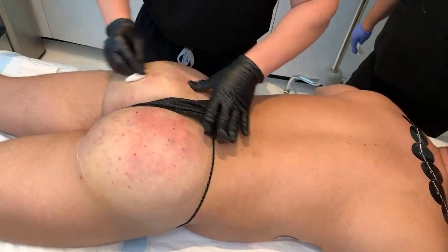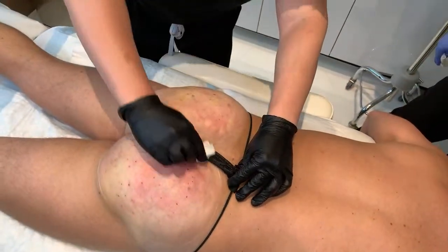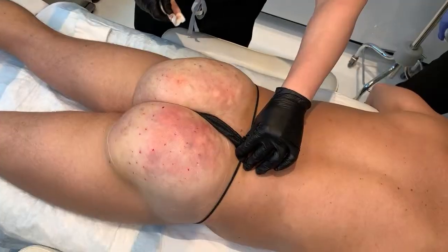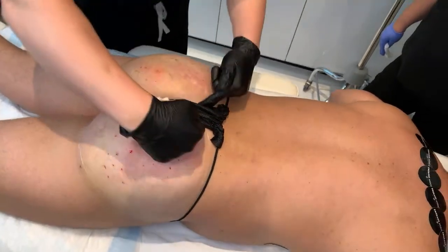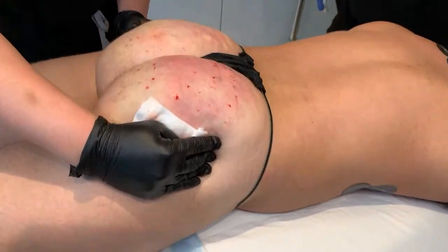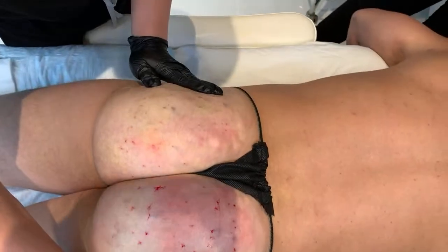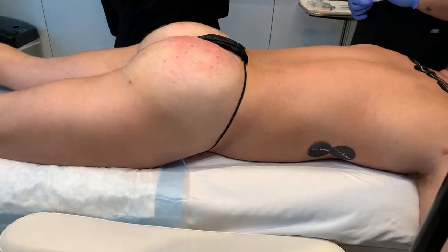And this is it, everything is perfect. So now squeeze as hard as you can so we can see. Good. So now we know where we can get in terms of results. And you could do a little pan and take a look, but the goal is to have a nice sort of lift, and when you press in, you could see the density mainly in this midline into upper portion. It's perfect. All right, you guys, that's SCULPTRA for male buttock augmentation, the soccer butt boost.